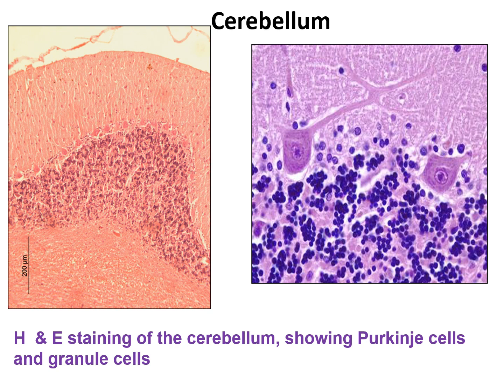This is the higher power of the cerebellum showing the gray matter. See, in lower magnification also one distinct big cell layer is visible. This is called the Purkinje cell layer. Cerebellum contains a special type of cells. Those are called the Purkinje cells. So these three layers, molecular layer, the granular layer and the Purkinje cell layer form the gray matter, and the deep part is the white matter.